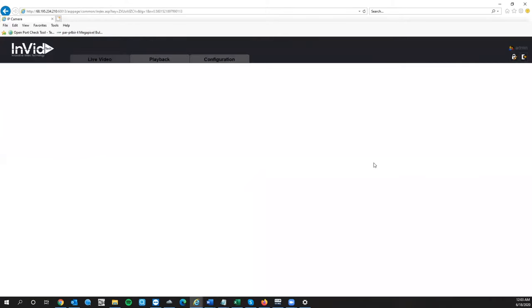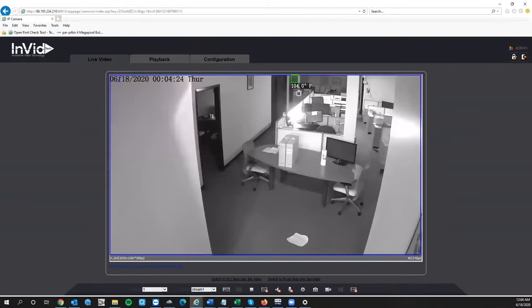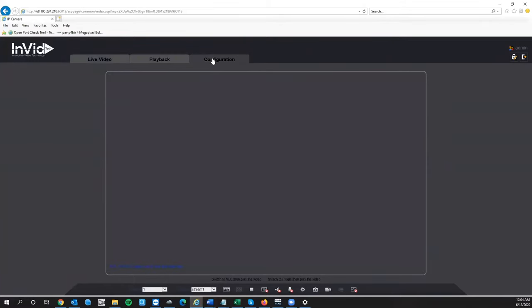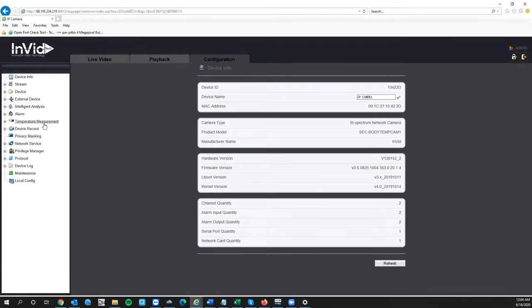I already changed the password, but if you're logging in for the first time, you'll get a prompt asking you to change your password to something more secure — go ahead and do that. After changing your password, it will pop up asking you to download the plugin. You're not going to use VLC; you're going to download the plugin for viewing purposes so you can see your camera feed. Once installed, you'll see the camera feed. The first thing we'll do is click on Configuration, then on the left-hand side click Temperature Measurement.